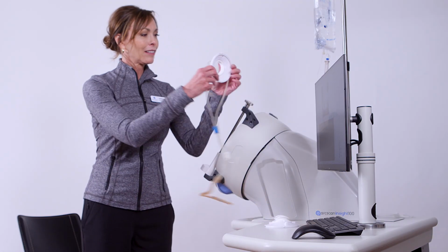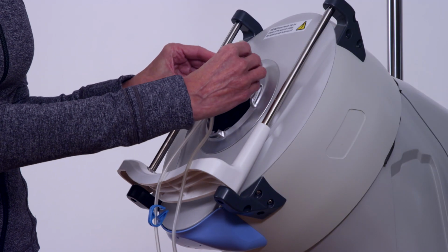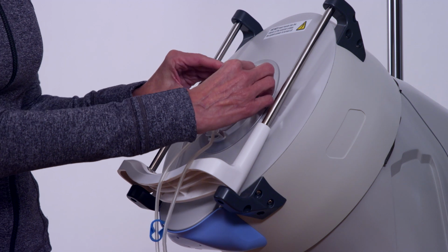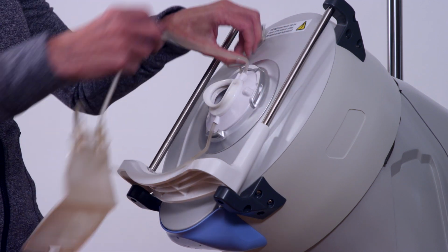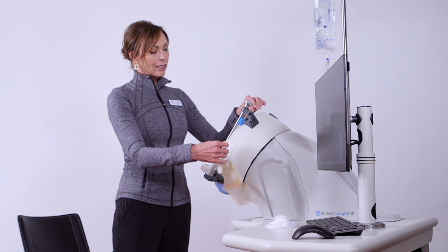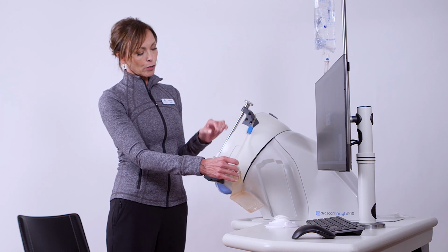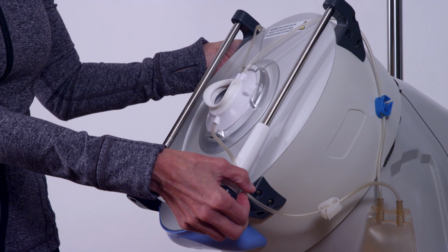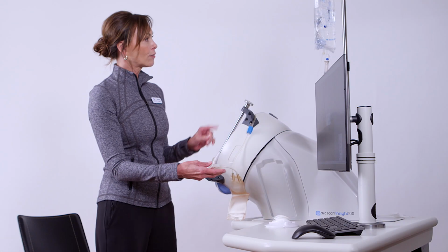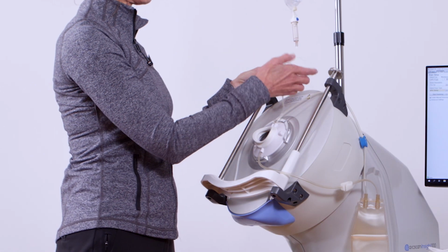It's usually best to attach the EyeSeal to the scan head before the patient comes in. Very simple. There are tabs here that fit right into these notches. You are going to have two tubes on top, and the tube with the blue clip will go just around this instrument right here. We're going to close the white clip and finally attach the BSS to this third line.